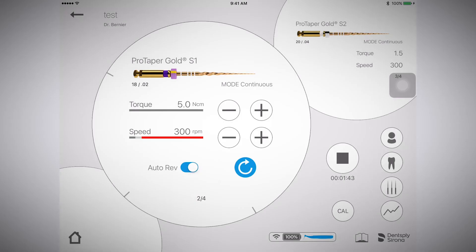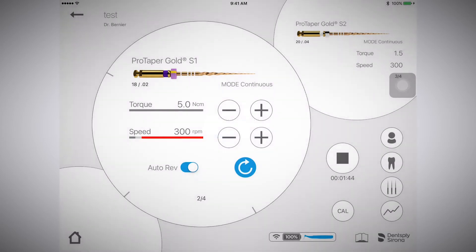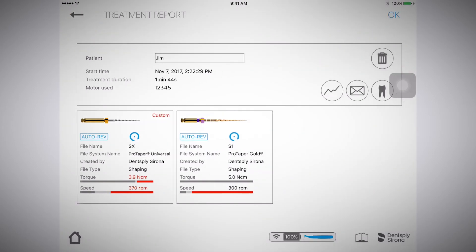Once the treatment is complete, stop the recording. Next, confirm that you would like to stop treatment. You will then see the treatment report.